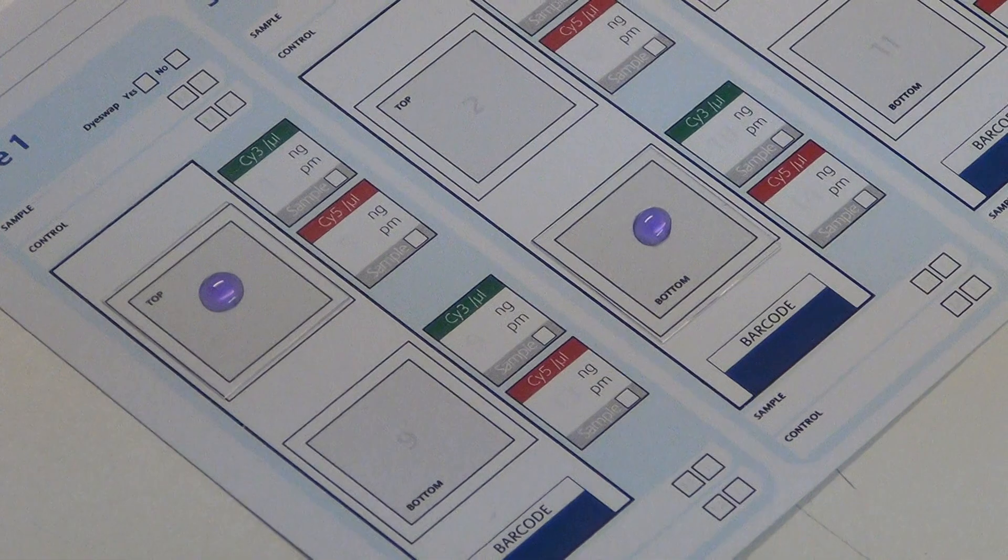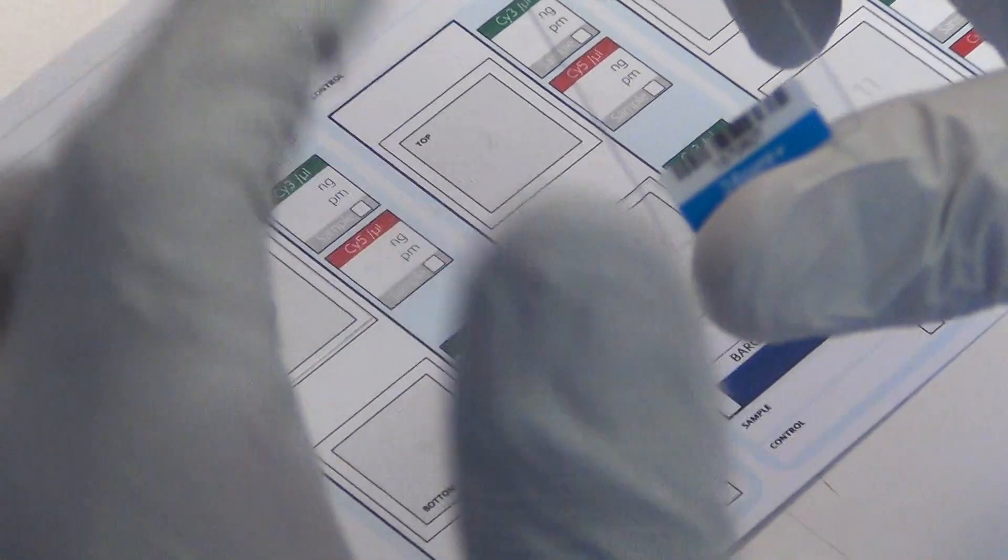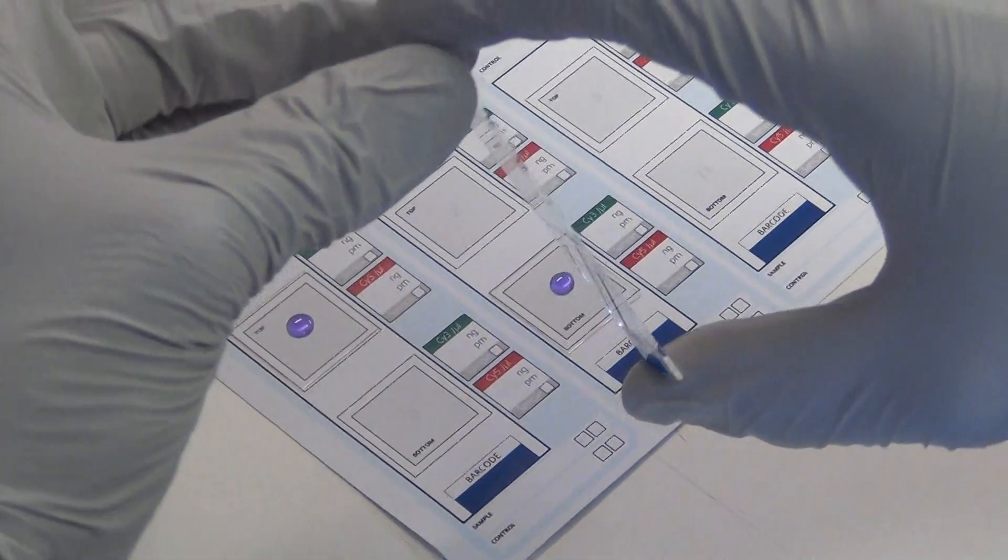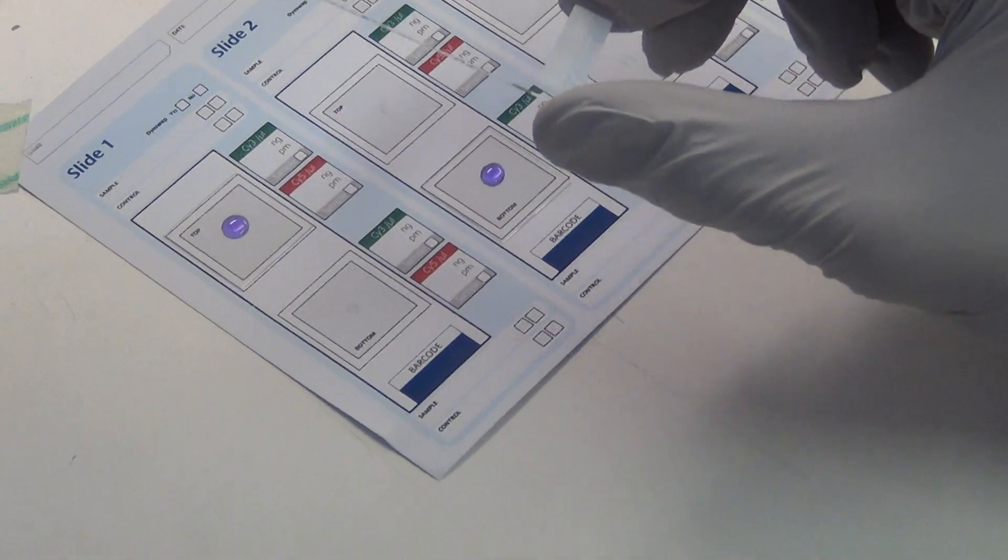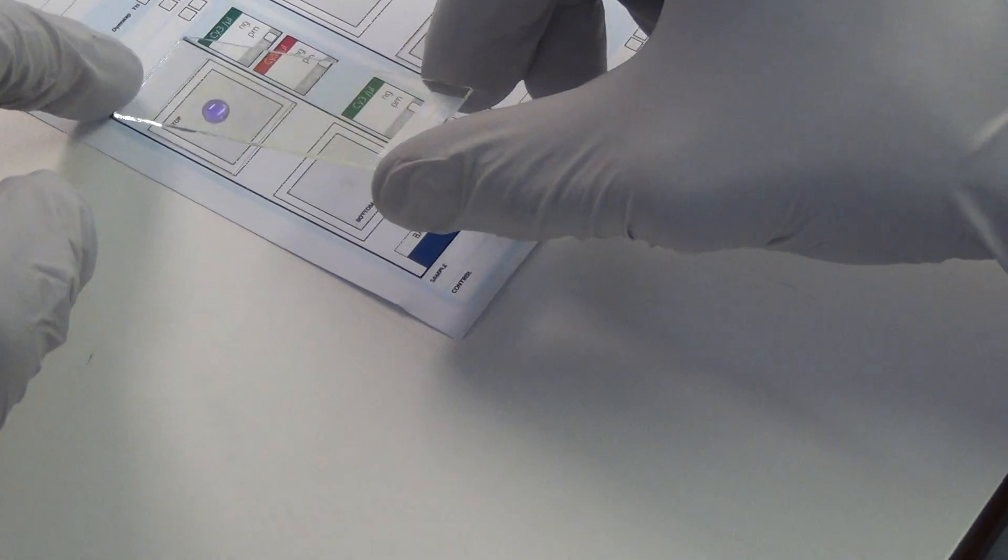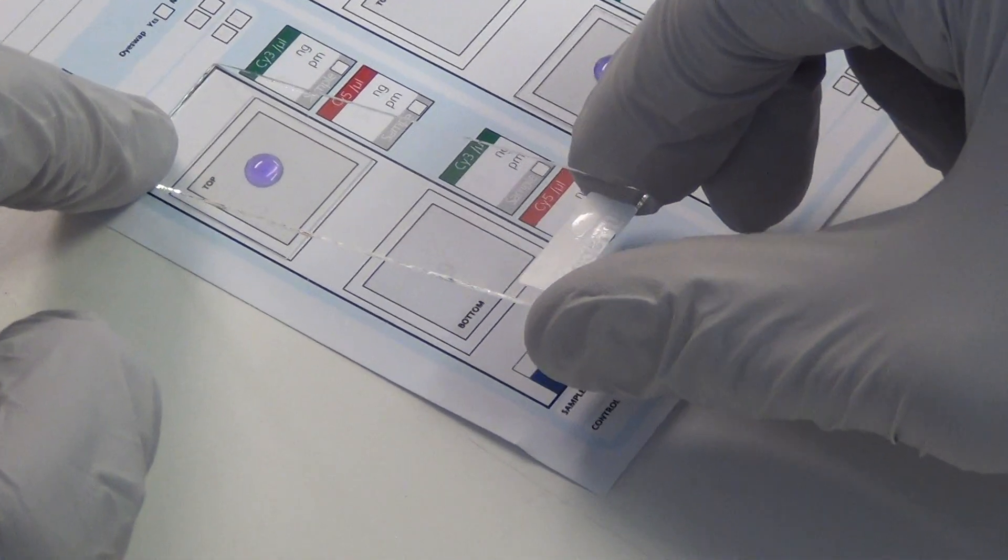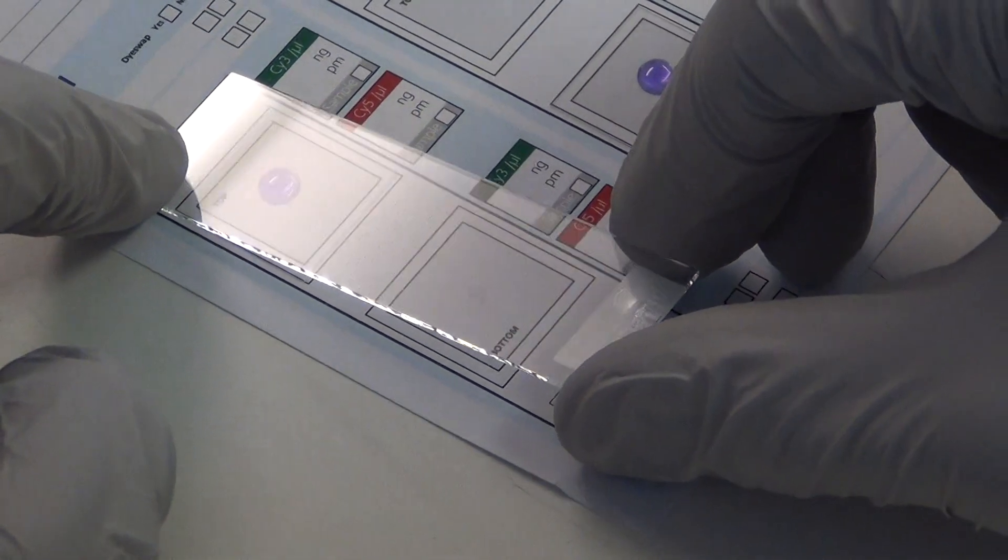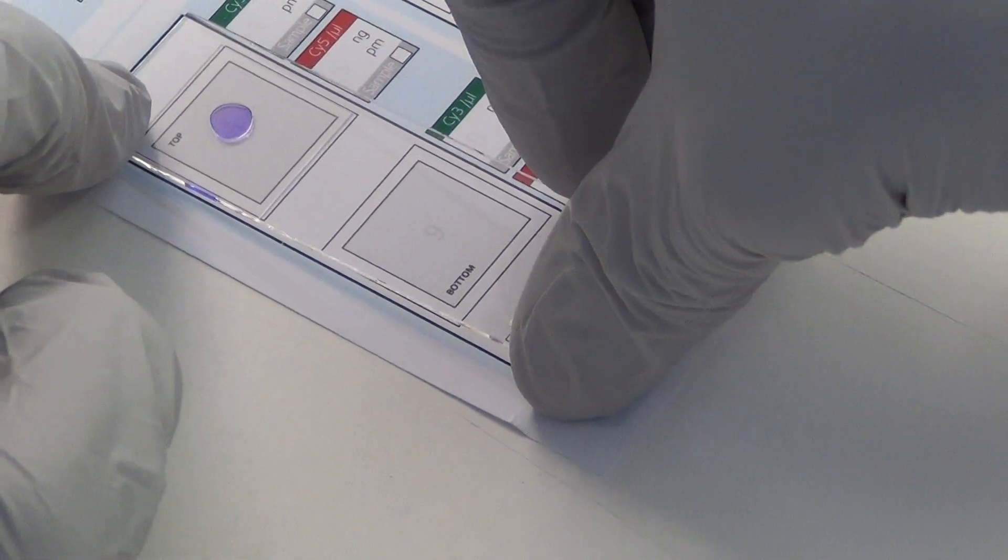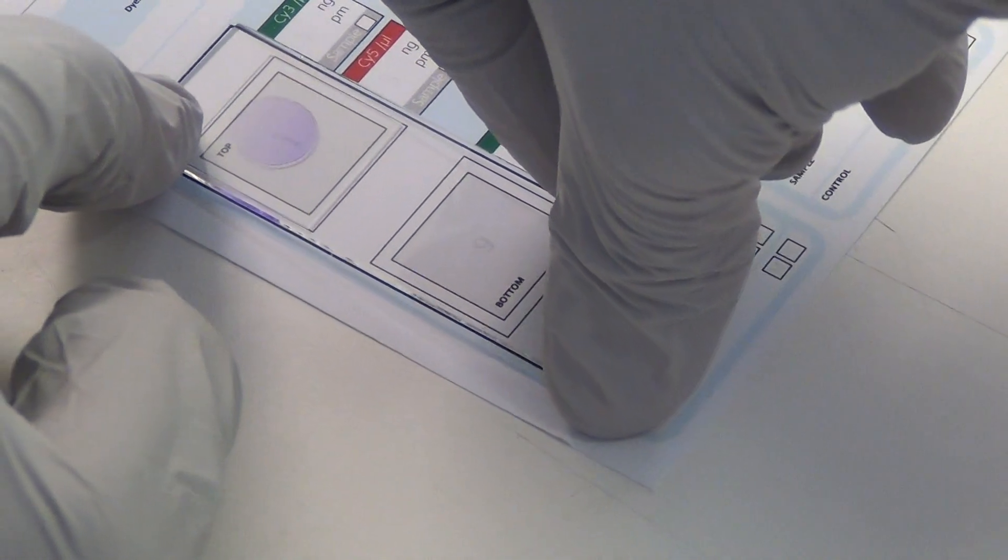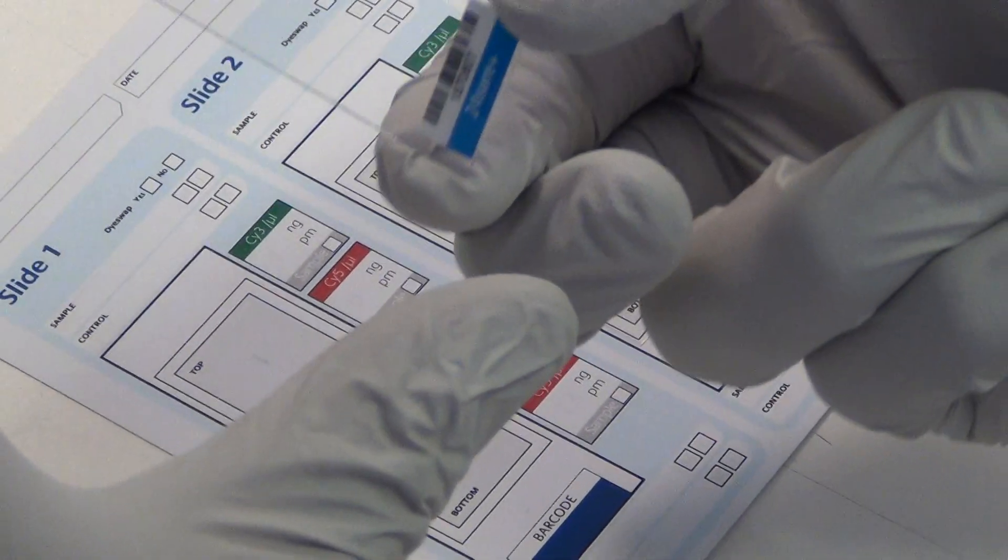Third, lower the active side of the array slowly onto the top coverslip at an angle until contact, again avoiding any formation of air bubbles.